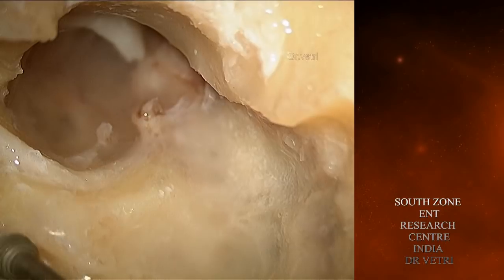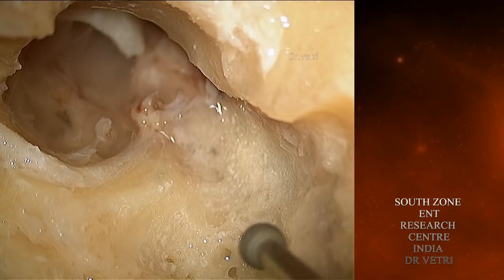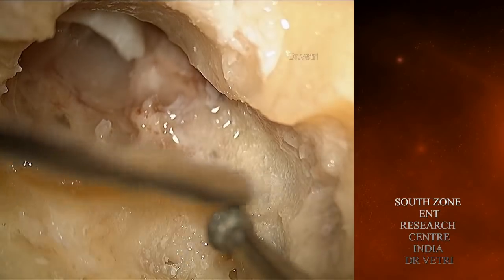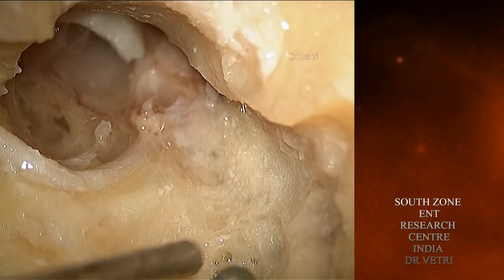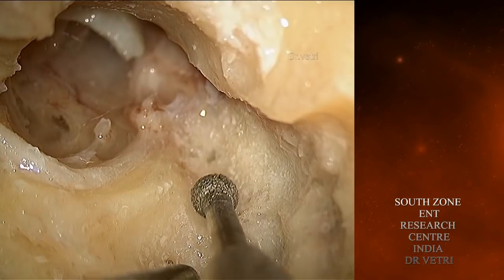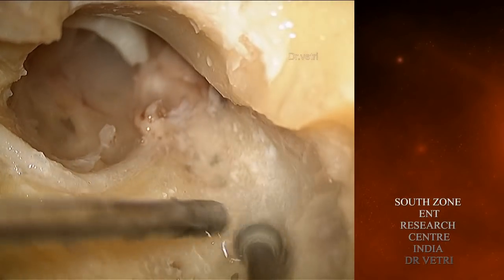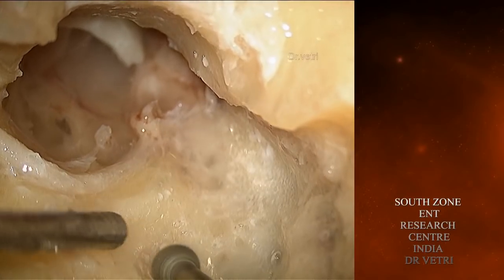Those are cells around the posterior semicircular canal. I am using a small diamond burr.